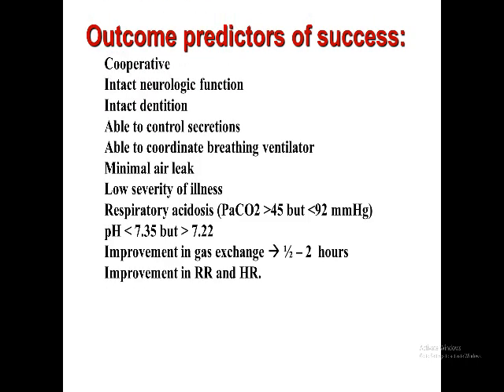Outcome predictors: my patient must be cooperative. There is intact neurological function, intact dentition, ability to control secretions, ability to coordinate breathing with the ventilator, minimal air leak, low severity of illness, respiratory acidosis, improvement in gas exchange, and improvement in respiratory rate and heart rate.